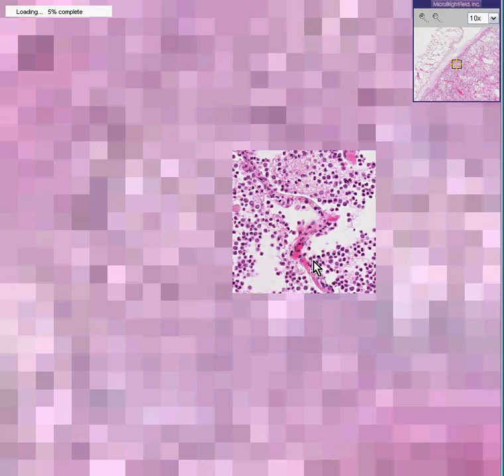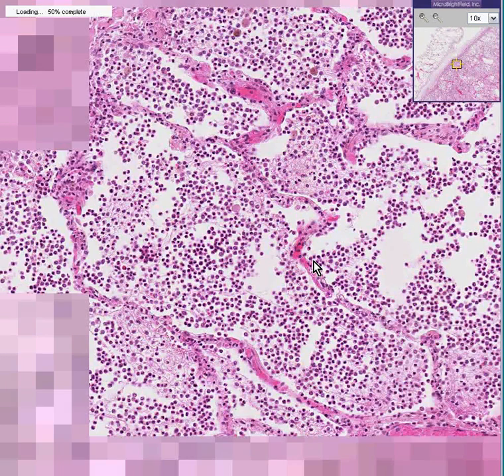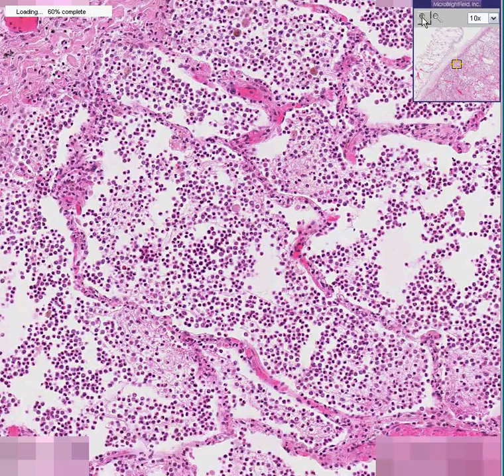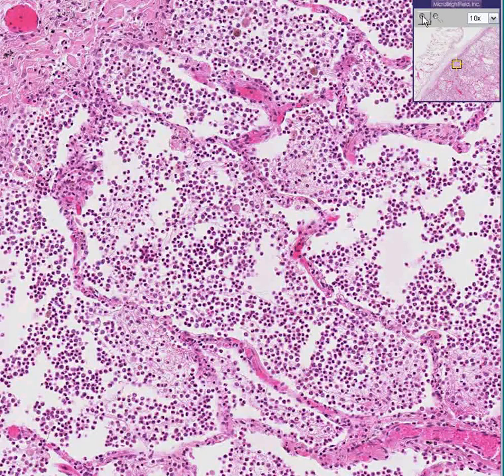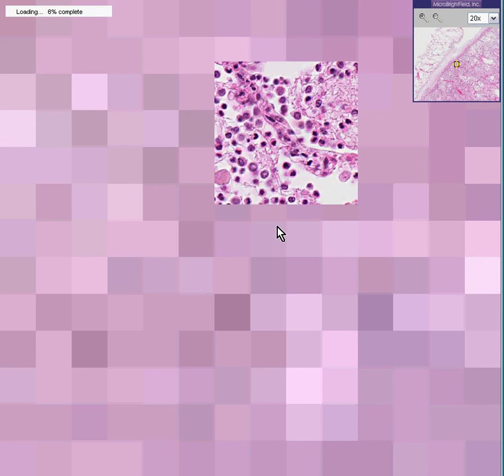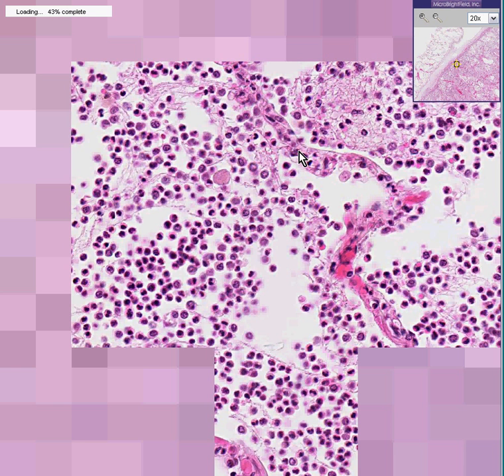Notice these are chiefly neutrophils. Notice there's perhaps a little bit of fibrin along here and along here, but for the most part, they're chiefly cells. This is an early bronchopneumonia. Notice that these septae appear to be fairly intact — they're not destroyed, but they are congested.